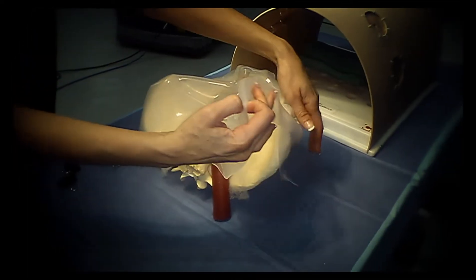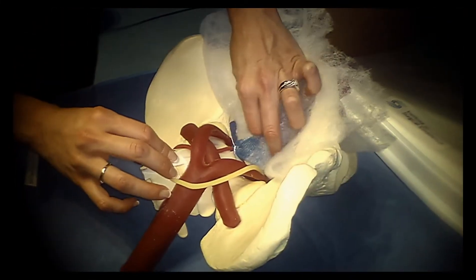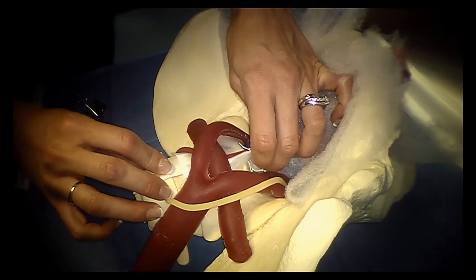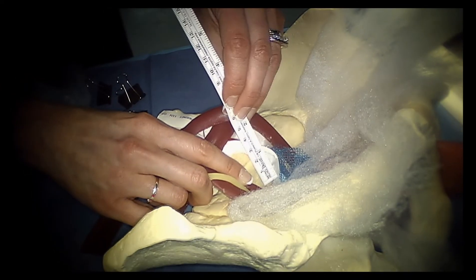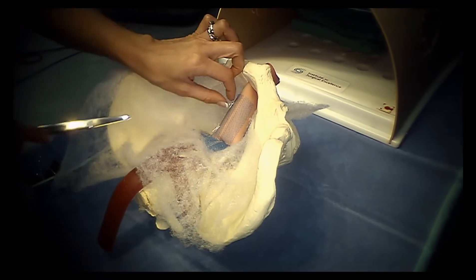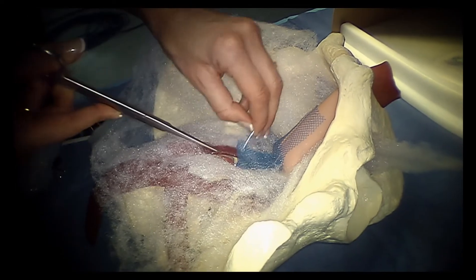Some strengths of this model are the ability for immediate feedback on surgical performance and reusability. Surgical skills such as knot integrity and knot placement can be evaluated to ensure that sutures are placed at the anterior longitudinal ligament at the level of S1, S2. For repeat use of the model, the knots are simply removed to release the mesh.